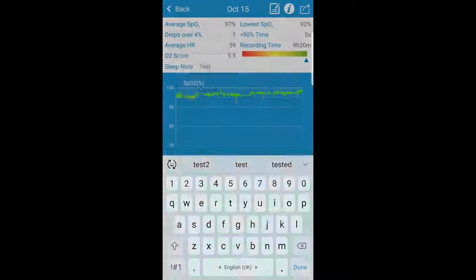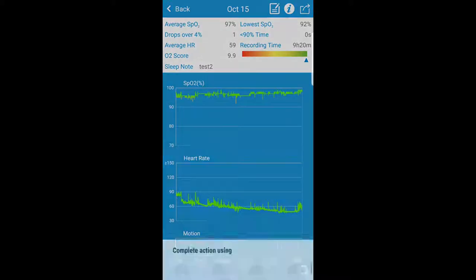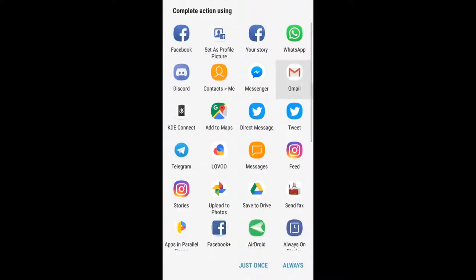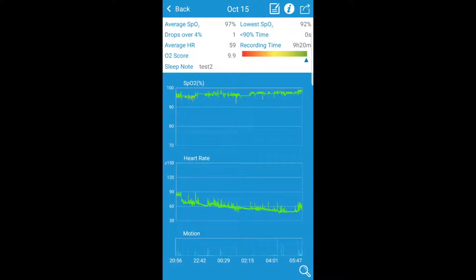We have the possibility to put sort of notes — I've already done that with a test entry, but let's redo that with test two. And you see in the sleep notes that it changes accordingly. We do have the possibility to share this information in various formats. Unfortunately, it is just a screenshot that gets sent over. What I would have liked to see is the possibility to export the data to a machine-readable format, for example for Sleepyhead or other kinds of software.